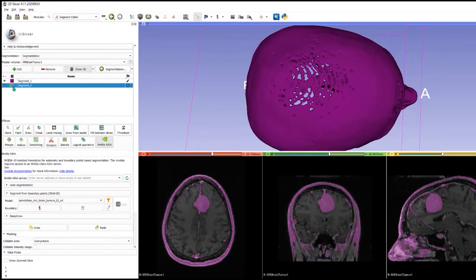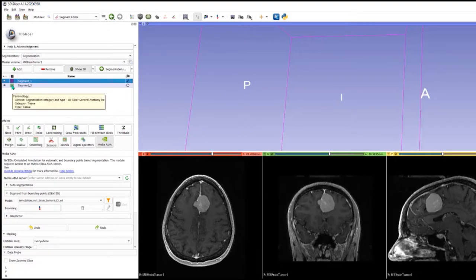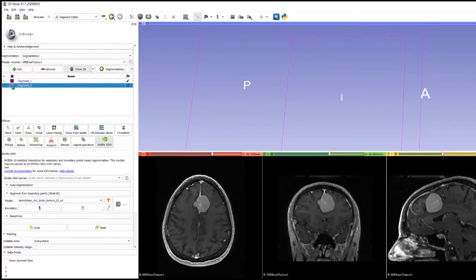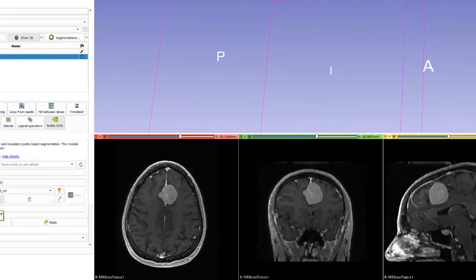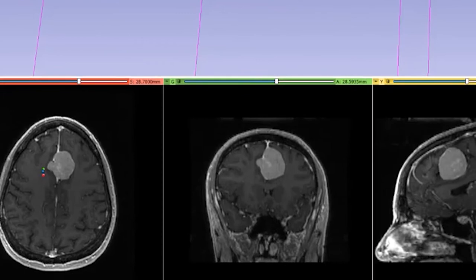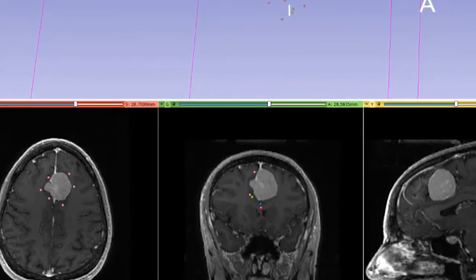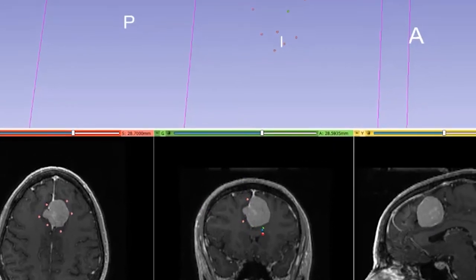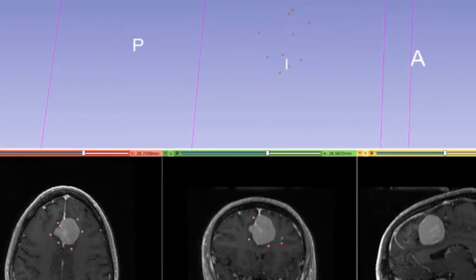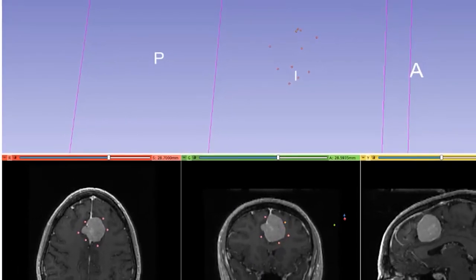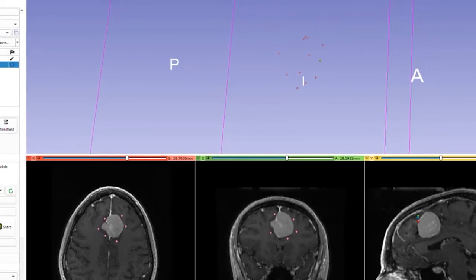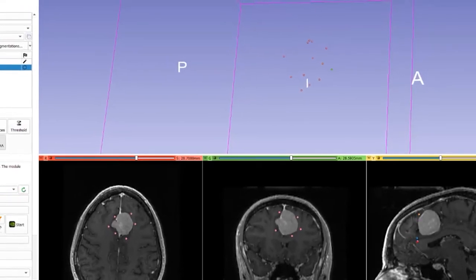I'm going to just draw some points. I'm going to take these boundary points and tell the algorithm roughly where is the tumor, where is the boundary for the tumor. You see the points appear in 3D space here. We don't have to be too close. Okay, that will do.